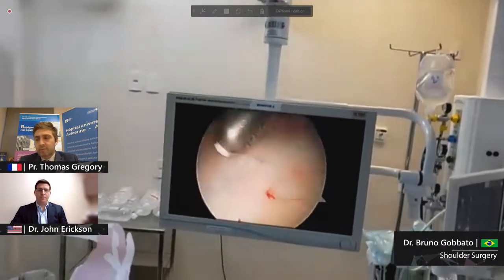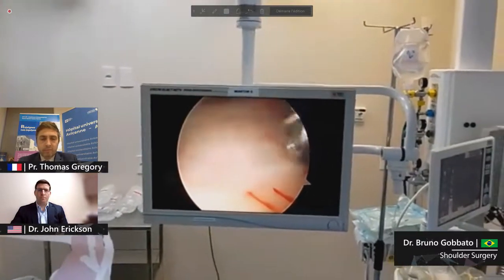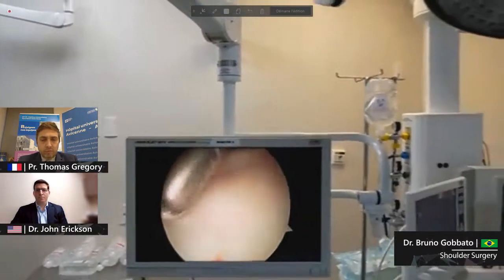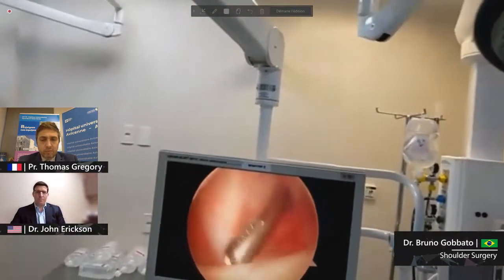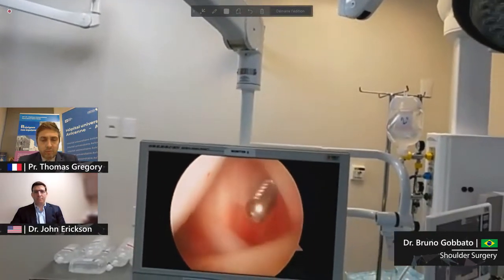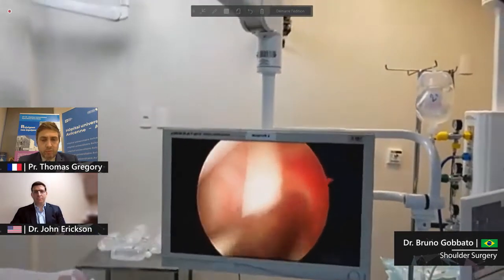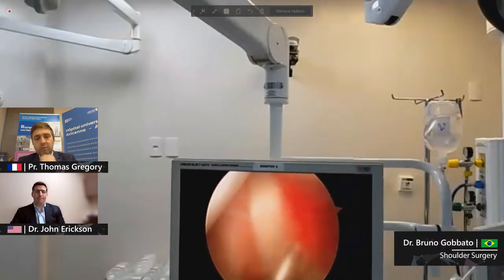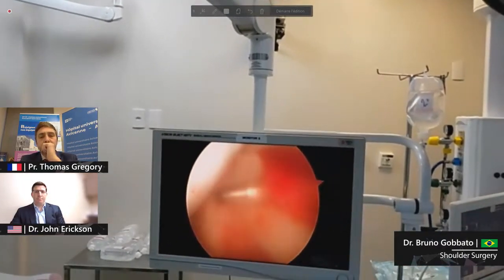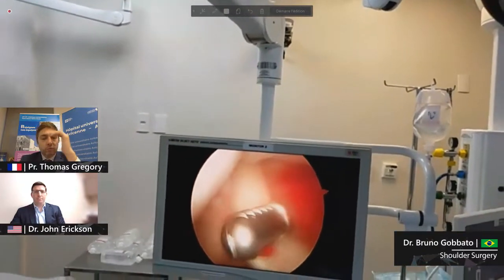It seems to have the bare spot, but maybe some small glenoid lesion, but very small. Let's see, here we have the interval, here we have the subscapularis. Let's check better with another view. And let's see the long head of the biceps. A 70-degree scope would probably be better to check, yes. But I think there is nothing here.